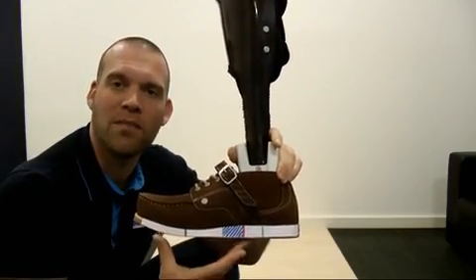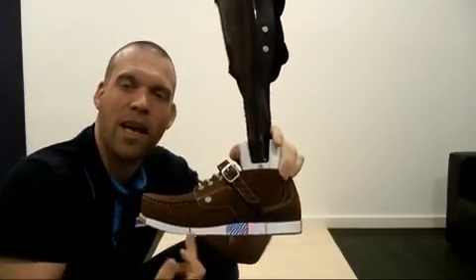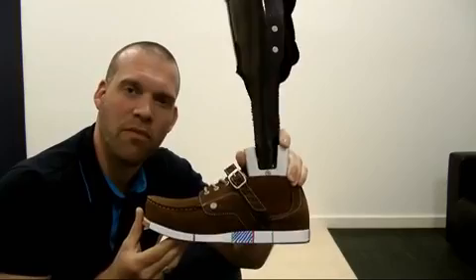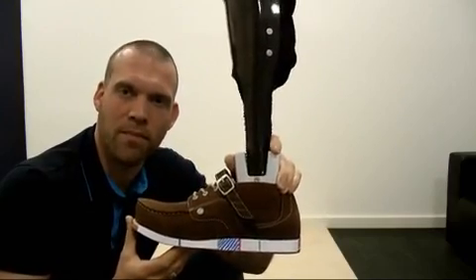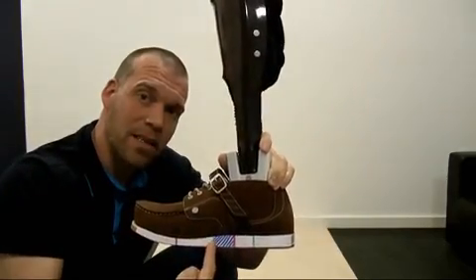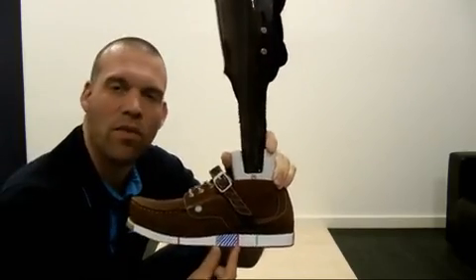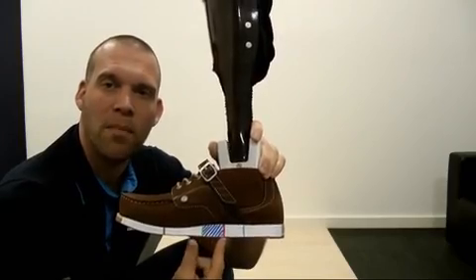To recognize the front half of it, that's pretty easy. We divide this area by 2, and if the center of gravity line from the mid-AP falls into the front half, that's not bad. However, to create ideal conditions for the dynamics, it makes sense to align the plumb line exactly and as physiologically as possible. That means it makes sense to drop the plumb from the center of gravity through the mid-AP so that it falls into the area that's hatched here. This limits the area through which the center of gravity should be supported much more precisely than just saying the front half. The question is, how do I identify this hatched area?